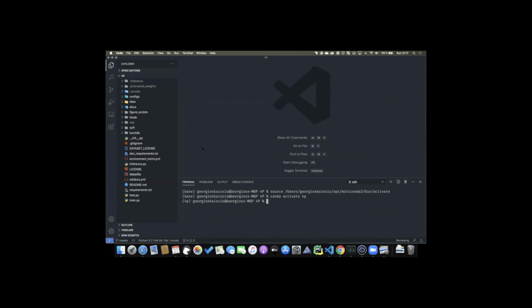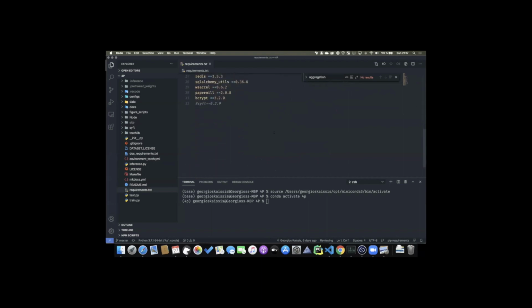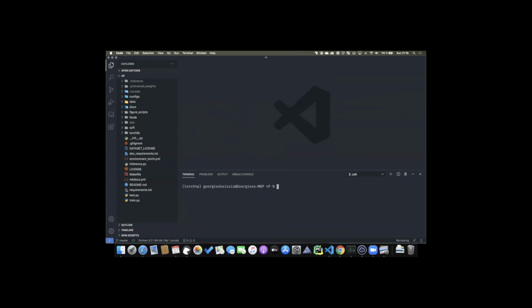So the first thing that you will probably want to do is create an environment, and to create an environment you can use this conda YAML file, and you can also use the makefile to do it. The command for it is make install. So if you run make install and you have conda on your system, it will create the environment for you. And if we ship updates, you can run make update and it'll update the environment with the new requirements. There's also the opportunity of doing it with pip. You can just run pip install -r requirements and it'll install all of the requirements. So the conda environment you will have is called torch4p, and you have to activate it. And you'll have the environment up and running, and from there you can run the various commands.